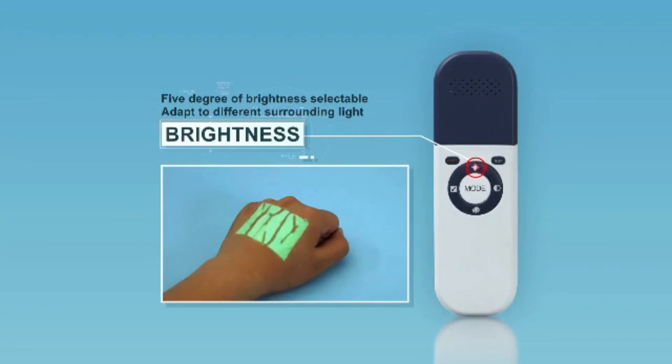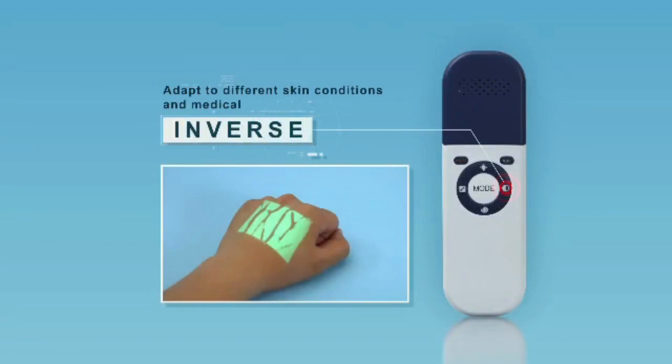Inverse mode helps the device adapt to different skin conditions and medical staff's preferences. Short press the inverse button to inverse the image.